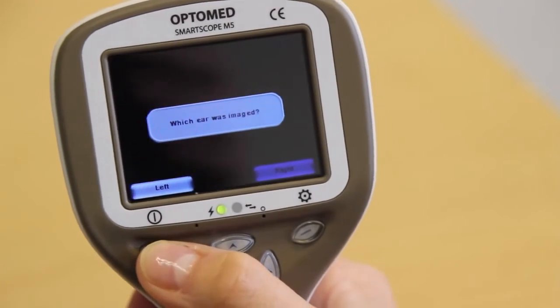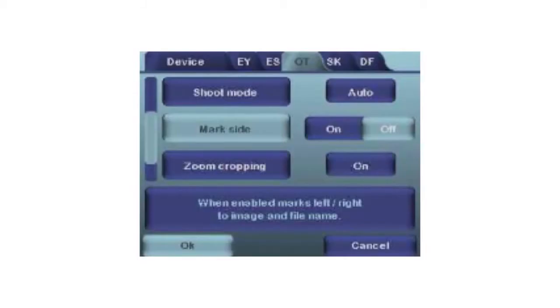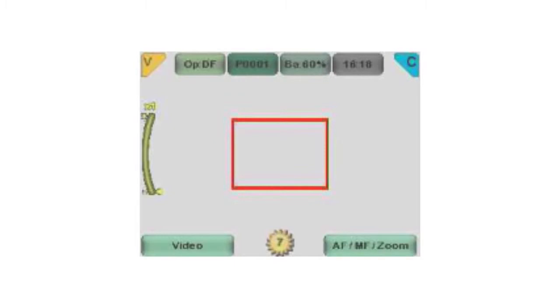Mark side. After each image, it is possible to mark which ear was examined on the image and the image file name. Marking side feature is available in the OT menu. Edit capture area. Due to slight differences between individual specula, the image area may not be completely visible or centered when using the zoom function. Press the middle key to activate the Edit Capture Area feature. The letter C will appear on the right top corner of the screen. Use the arrow keys to move the image area to the center.